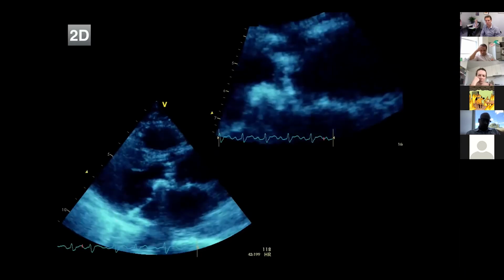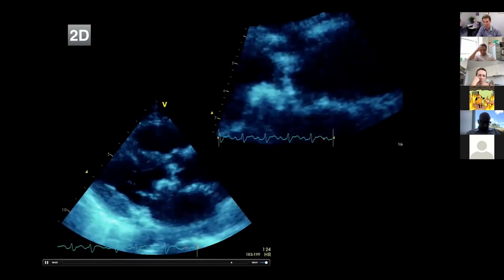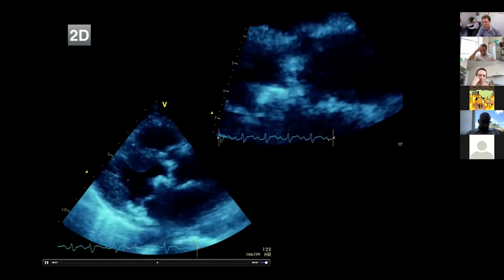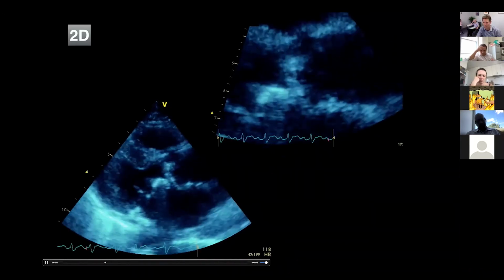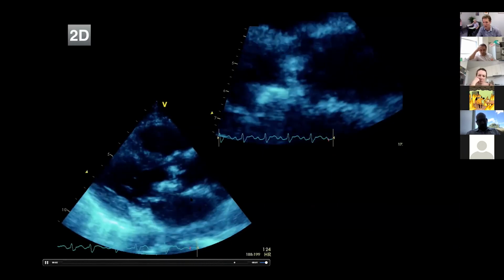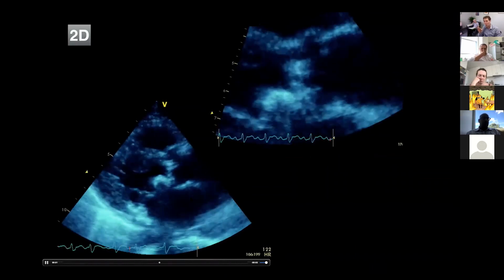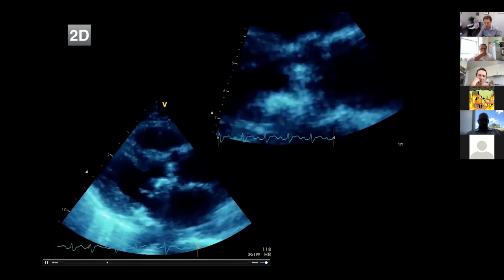You'll notice that we've got a big hypertrophy that's here associated with it as well. Take note that maybe the ejection fraction looks okay in this view. Maybe we're dealing with a small stroke volume potentially, so normal ejection fraction, maybe small stroke volume, worth keeping in mind as we get towards the end. And other valves being blocked up as well. Decent sized left atrium. All of this stuff's going through my mind saying, yeah, this could be significant aortic stenosis. I have to make sure my Doppler imaging is correct, so don't mess around with this case. Take my time, look at it from lots and lots of different angles.